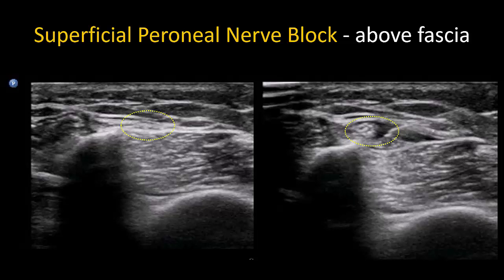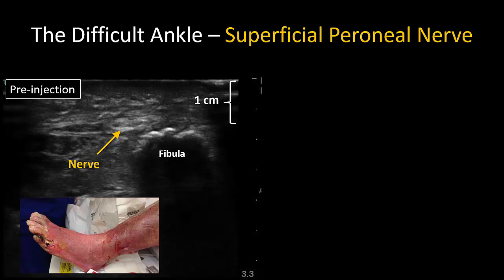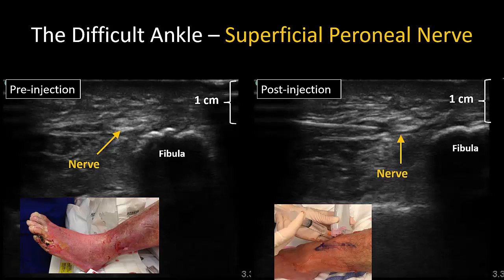Here is another example of a superficial peroneal nerve. Note how it is flattened in the pre-injection state, and as local anesthetic distends the space in which it lies, it starts to adopt the usual round cross-section. The superficial peroneal nerve remains easy to identify even in the edematous and indurated leg. Follow the sequence of steps described to locate the nerve, and it can be visualized and targeted even when the subcutaneous tissue is edematous.